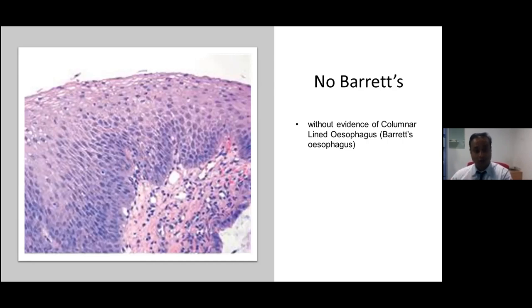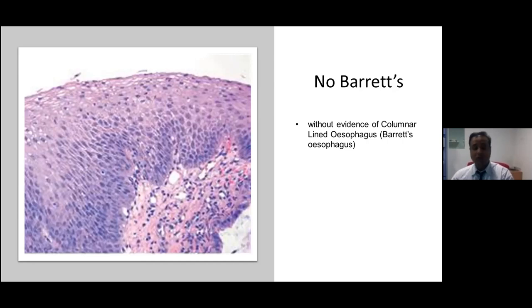Look carefully for any neutrophilic infiltrate. If there are neutrophils on the surface epithelium, a PAS-D or Grocott stain would be helpful to rule out any Candida. Also look carefully for herpes simplex inclusions — glassy inclusions, binucleate cells — or any CMV inclusions. These are the sorts of things to look out for.